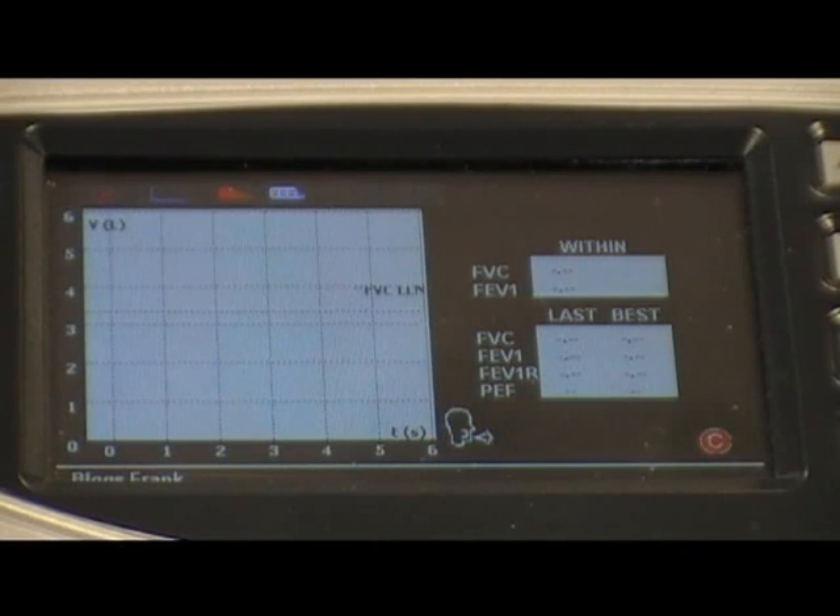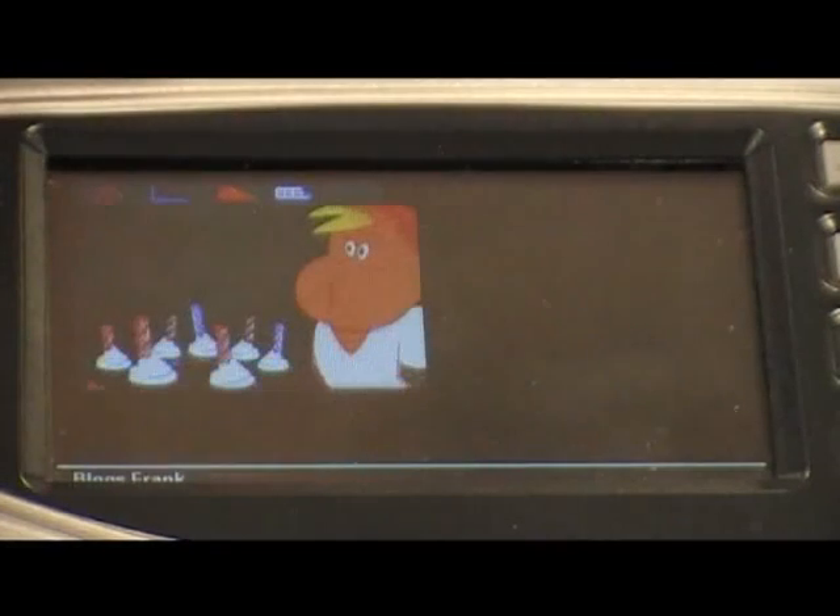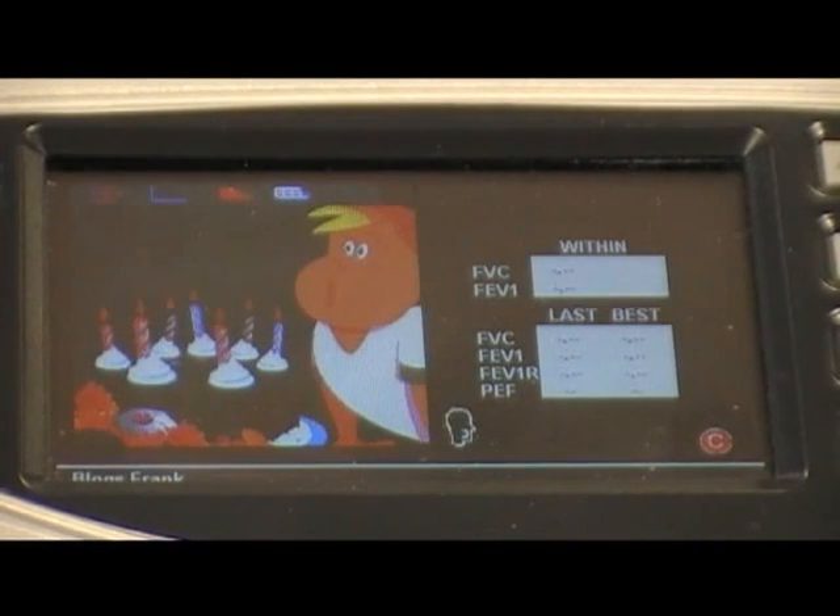The AlphaTouch also has incentives for children. To use the incentives, click on the carrot icon on the testing screen. This will display the incentives and allow you to start testing the child.